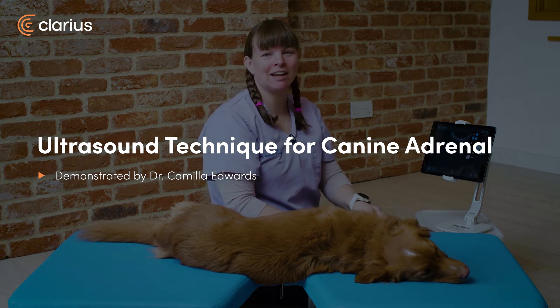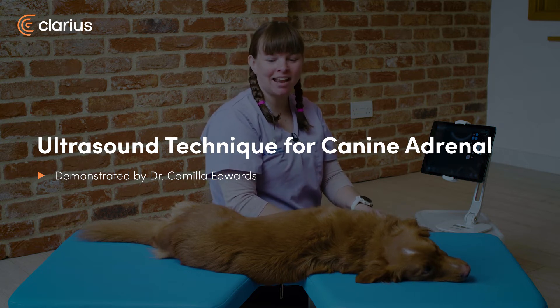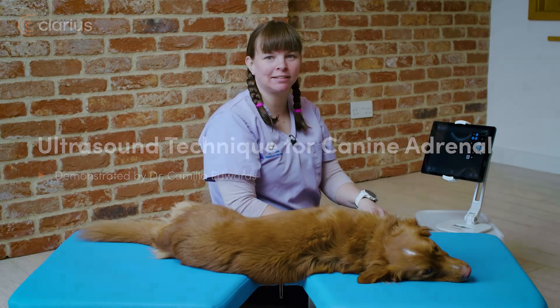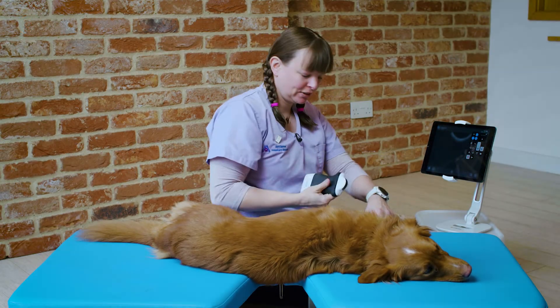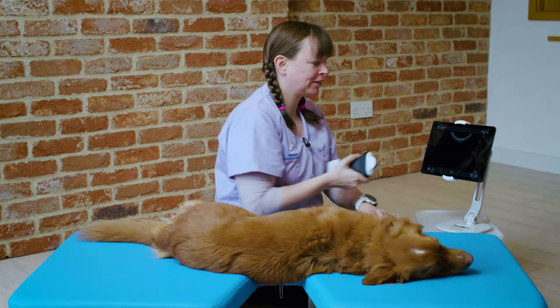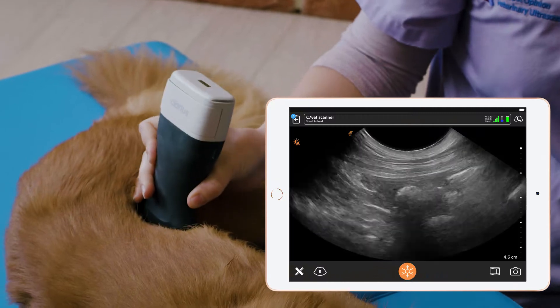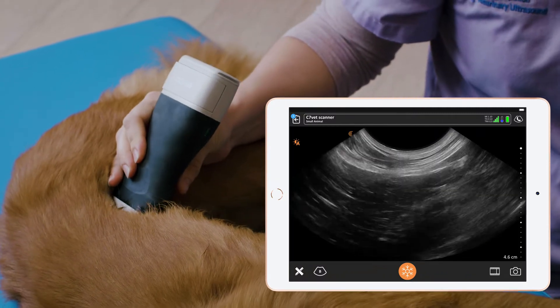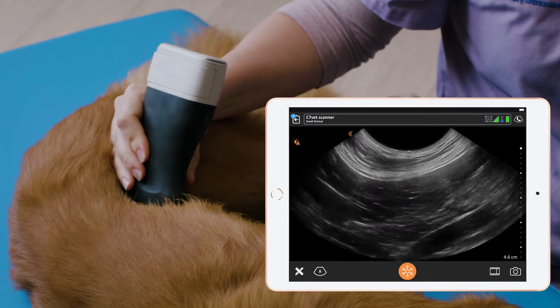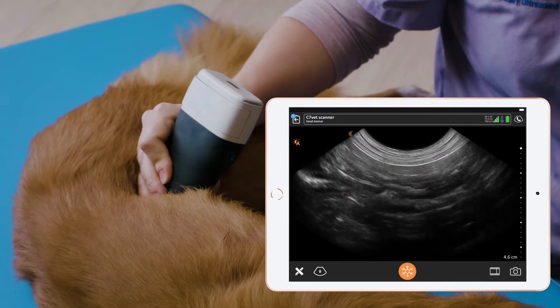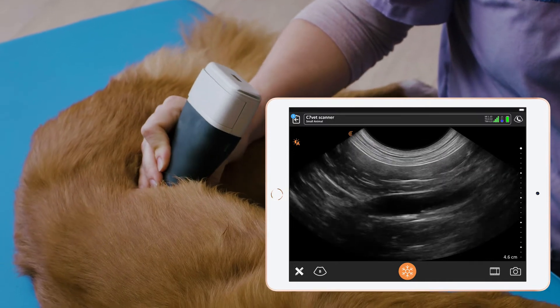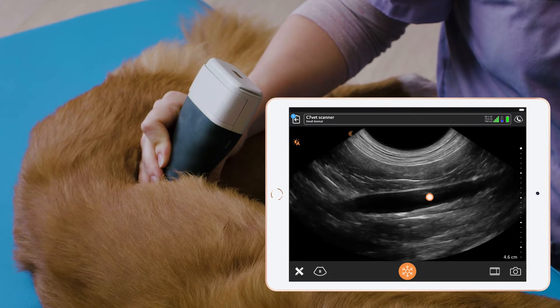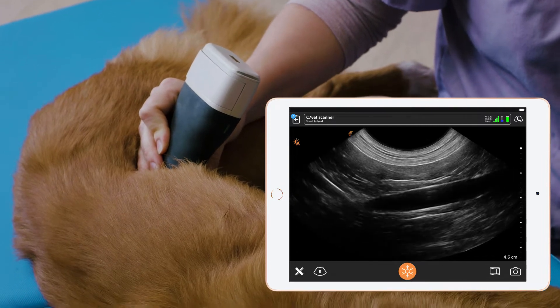Hello, my name's Dr Camilla Edwards and today I'll be teaching you how to scan the adrenal glands. First we want to find the aorta. We find that mid-abdomen up towards the spine. We're looking for this long anechoic tube here at the top of the screen, and we can see it pulsating.